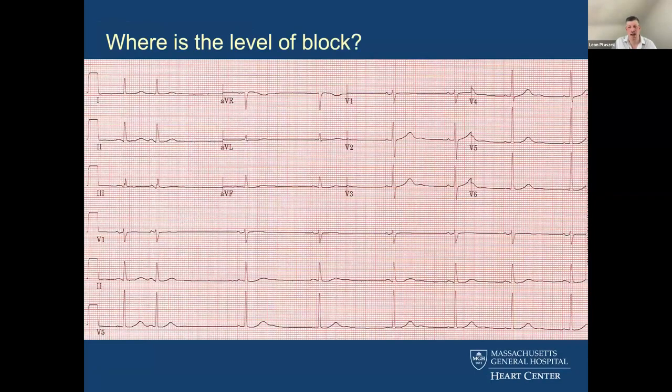So as you might guess, deciding on who needs a pacemaker and who doesn't is going to be based in large part on where the level of block is. And I'm not going to call on people during today's session. I just want to go through a few basic tracings, which I think are going to be a review for most of the group, just highlight a few basic concepts.